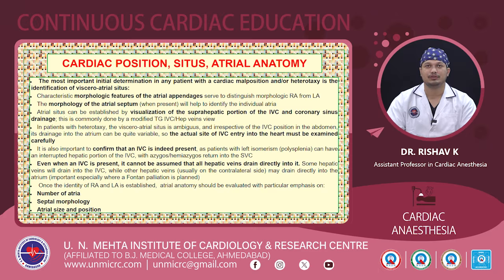Thirdly, the visualization of the suprahepatic portion of the IVC and the coronary sinus drainage, which is commonly done by a modified transgastric IVC or hepatic veins view. Here we have to visualize the actual site of IVC entry into the heart, because the visceroatrial situs in patients with heterotaxy can be ambiguous, and irrespective of the IVC position in the abdomen, the drainage into the atrium can be quite variable.